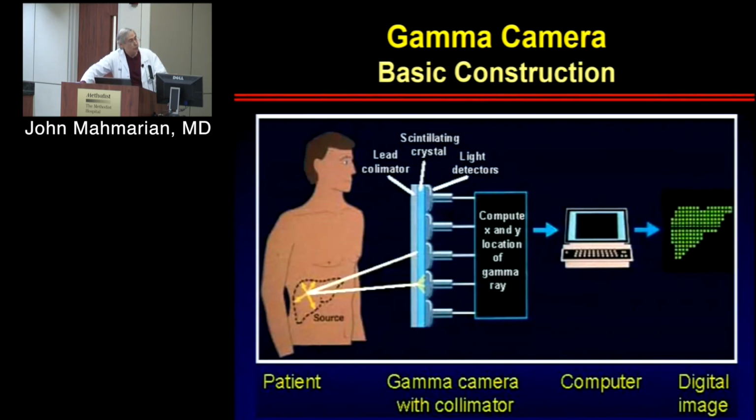But this particular crystal, sodium iodide, will, with the photon going in and hitting the crystal, cause a photoelectric effect, which will cause a scintillation, and that scintillation, through the use of PM tubes, photomultiplier tubes, will multiply the light that's being emitted, and then that will be detected by a grid in terms of producing a picture. Okay, so the X, Y, and Z axis are then identified.